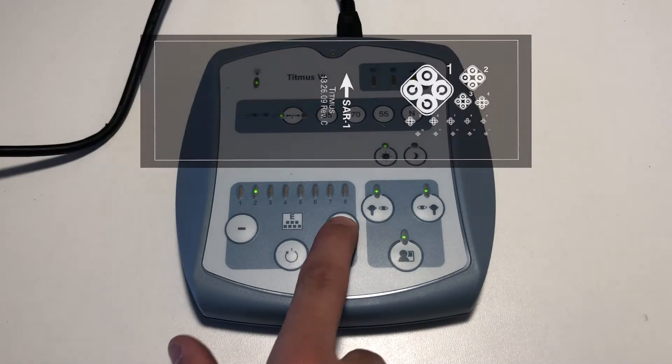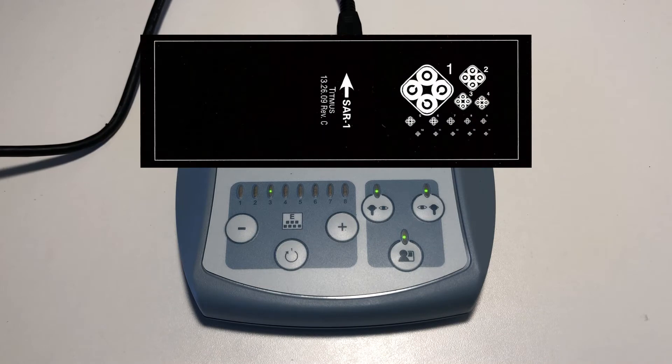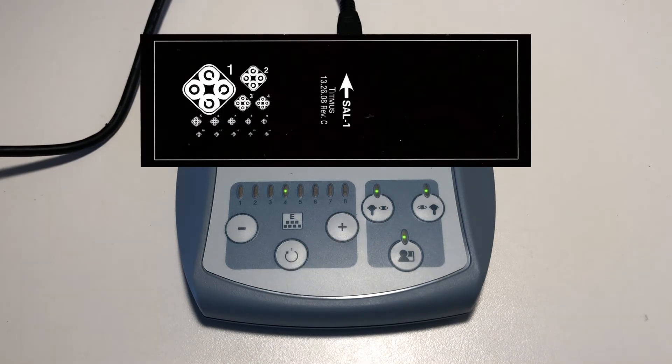Slide number 3 and number 4 are similar, but test just the right eye and then just the left eye. The procedure is the same as for slide number 2.